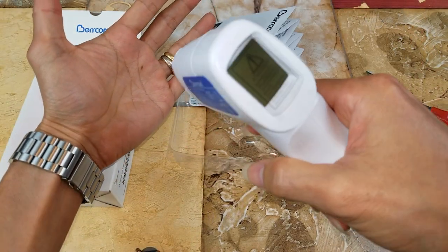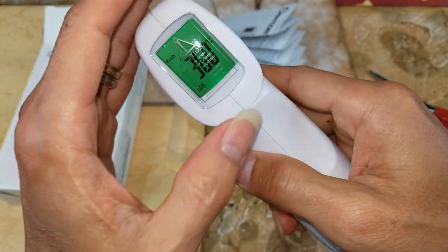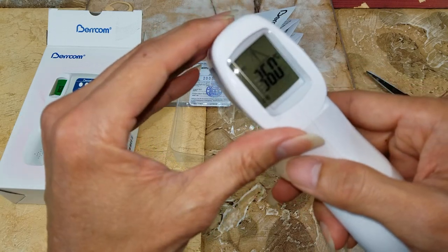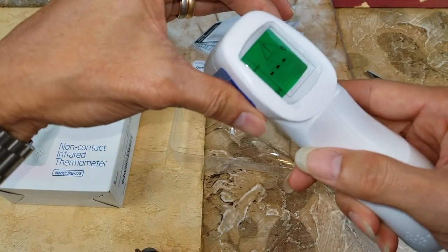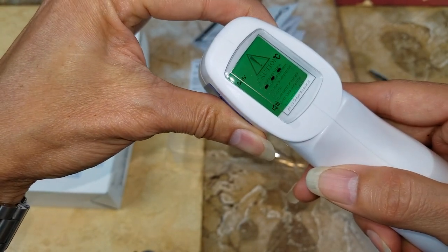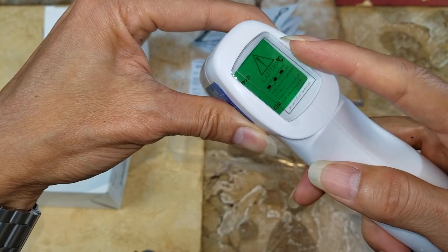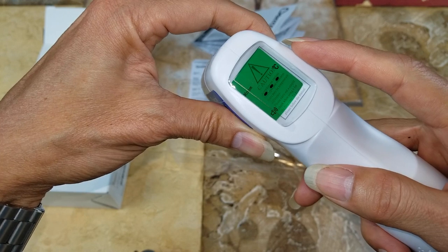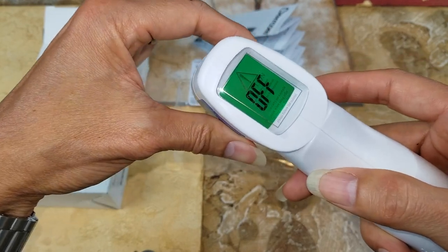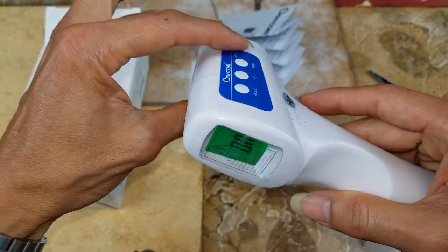It shows a temperature in degrees Celsius — 36. I'm pressing the mode right now. So there are three different settings: surface temperature, body temperature, and room temperature. This button is the speaker on/off or beeping, and then this one is memory.